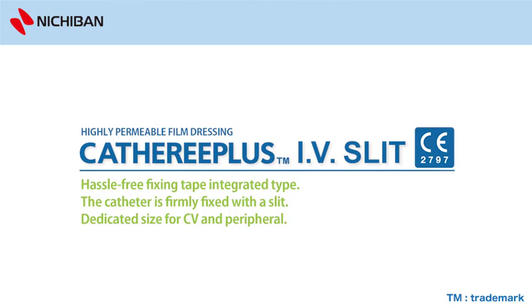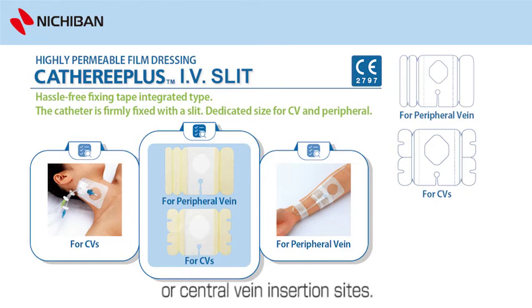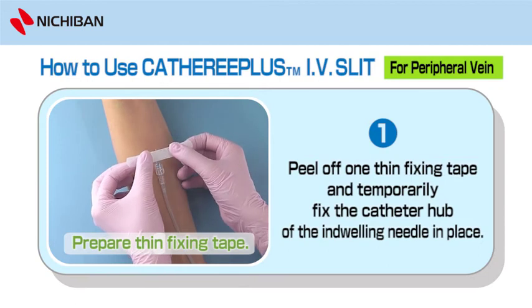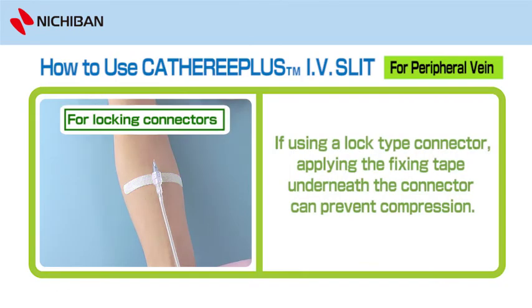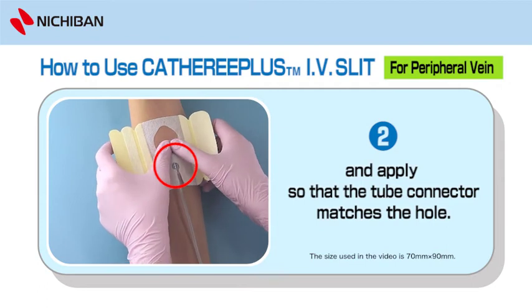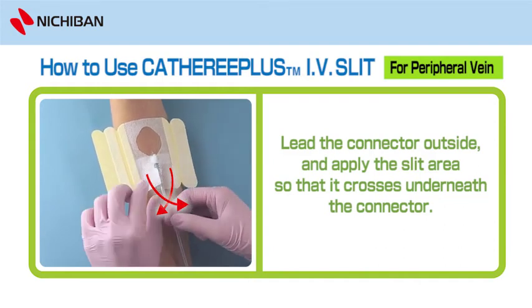Catharee Plus IV Slit, sterilized by EOG — dressing for holding catheter needles in place. This can be used for purposes such as holding at the peripheral or central vein insertion sites. To use Catharee Plus IV Slit for peripheral vein: 1. Prepare thin fixing tape. Peel off one thin fixing tape and temporarily fix the catheter hub of the indwelling needle in place. If using a lock type connector, applying the fixing tape underneath the connector can prevent compression. 2. Slowly peel off the central release liner. Hold the yellow release liner on both sides and apply so that the tube connector matches the hole. 3. Leave the connector outside and apply the slit area so that it crosses underneath the connector.